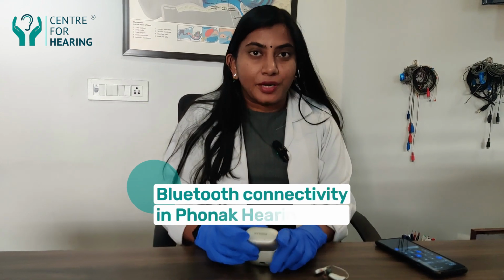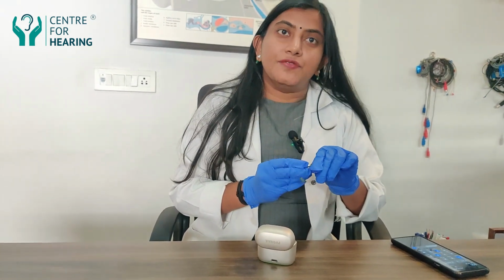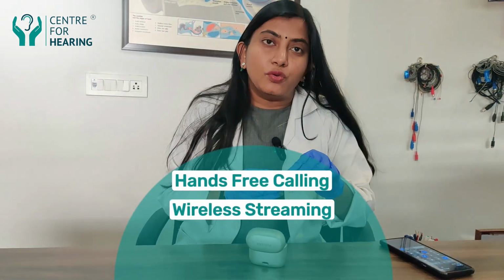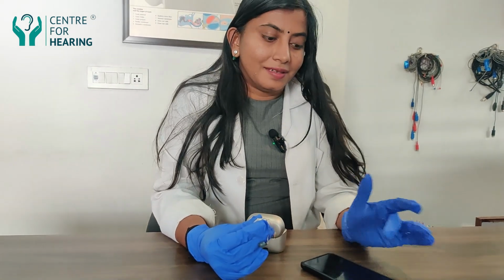Today I'm going to speak about the Bluetooth connectivity in Phonak hearing aid. Latest technology hearing aids in Phonak have Bluetooth connectivity, which enables hands-free calling and wireless streaming, and improves the sound quality. So I'm just going to demonstrate how it has to be paired with your phone. Whether it is Android or iPhone, it pairs in the same way.